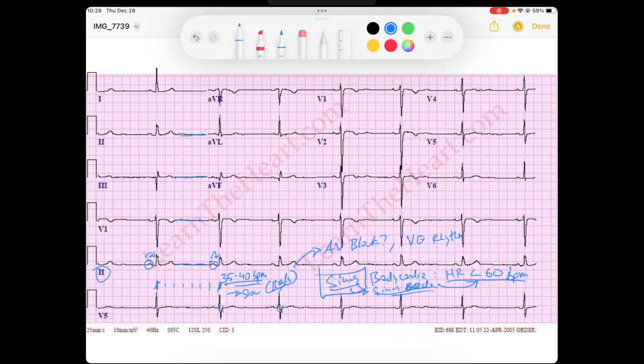And I need to determine if it's to say this is a sinus bradycardia. That means that the P waves must be generated by the sinus node. And you hear me do this with every EKG. I always look, when I'm evaluating my P waves, I look at lead one, and I look at AVF. And my P waves, if they're upright in one, and if they're upright in AVF, I can say that it's going down to the left and that is a sinus P wave.